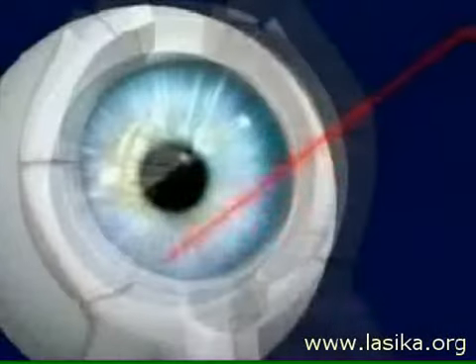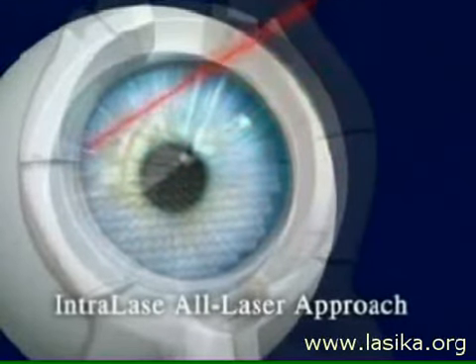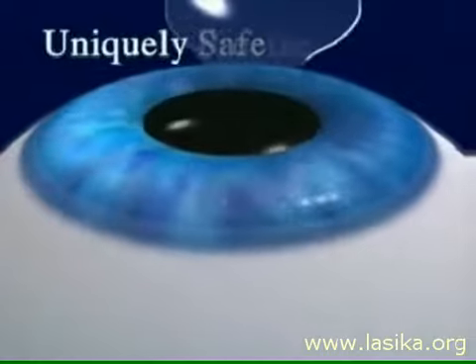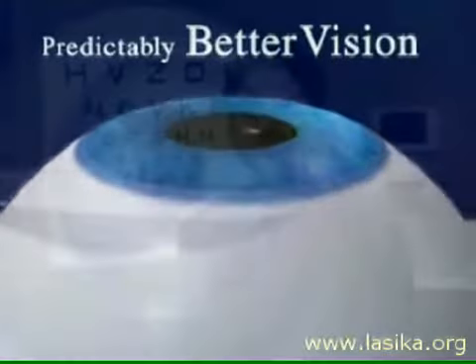For the last several years, we've had another method of creating the corneal flap. A laser called an Intralase can create tiny bubbles in the cornea. These bubbles then coalesce and create a flap. The Intralase, because it uses laser technology, is both safer and more precise than the mechanical blade.